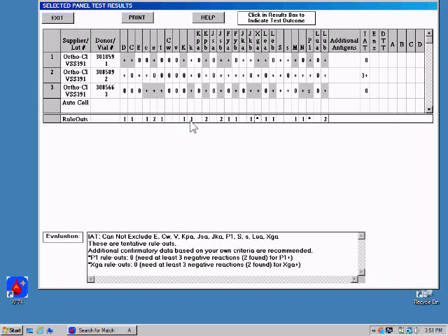We can see that big D, big C, and little c have each been excluded on 1 homozygous or double dose cell, and little e has been excluded on 2 homozygous cells. Our next step is to do a full panel to identify our problem antibody. Once you have pulled out your panel and set up your testing, you'll come back to Antigen Plus to bring your worksheet up to date and have it ready to enter your results when your testing is complete.